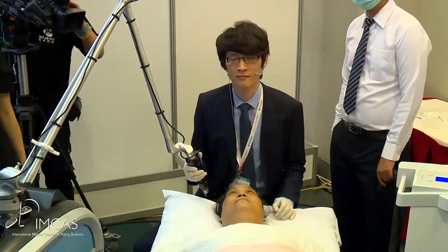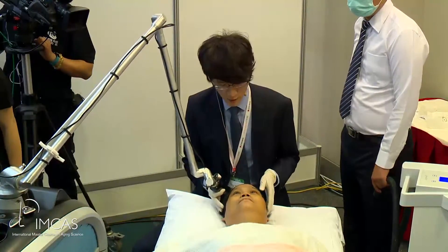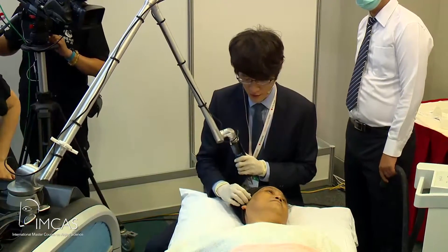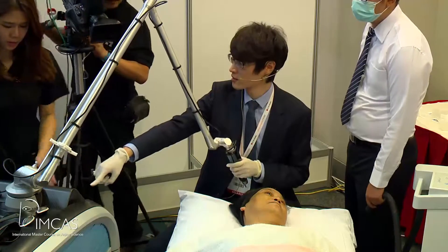Dr. Singh, can you just do half the face because we are short of time here. I understand. So we will just do the right side of our patient's face. And what I'm going to do is similar but a little bit different from Dr. Lin. Do we have the image? Can we have the image on the screen?